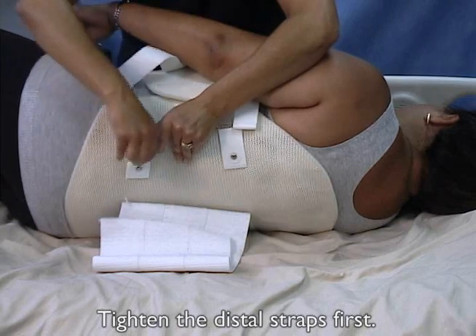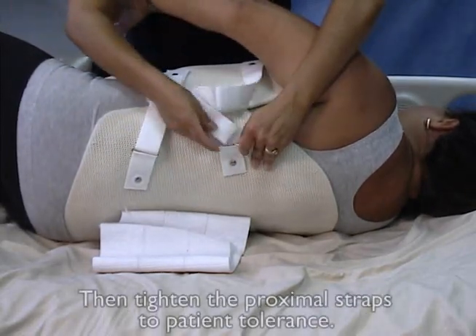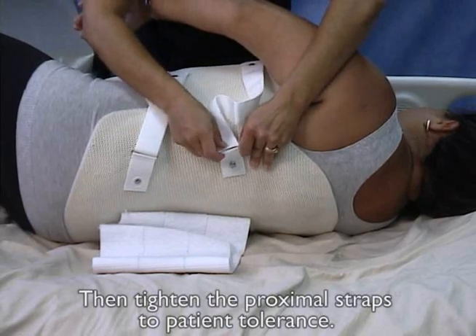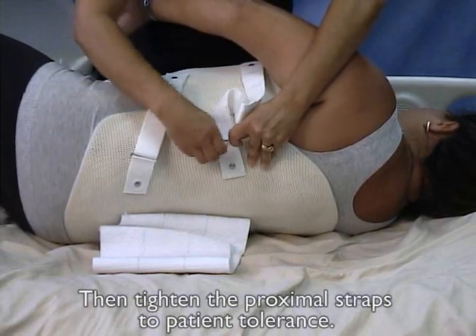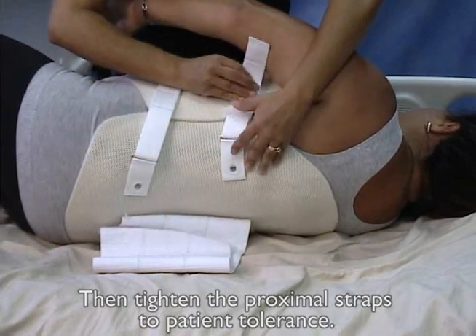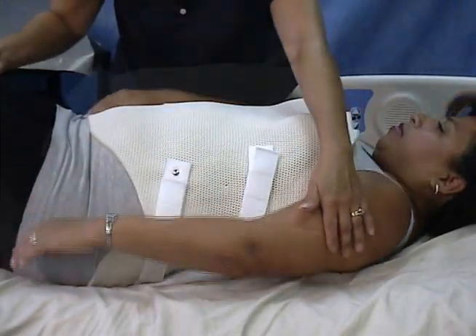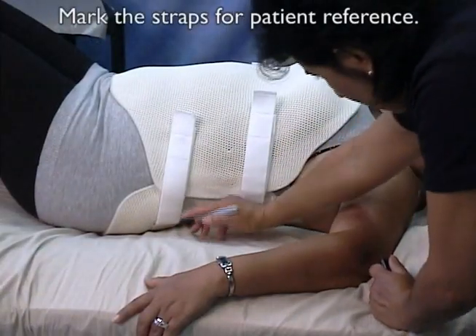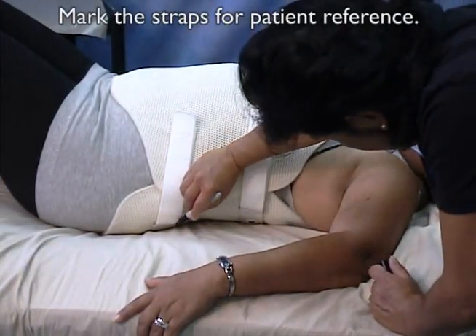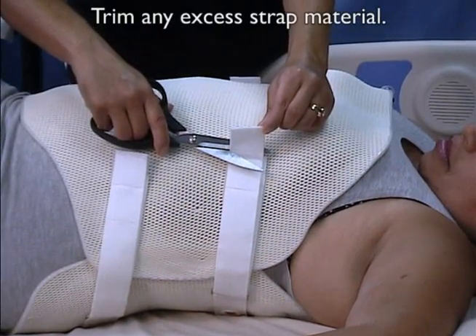Tighten the distal straps first, then tighten the proximal straps to patient tolerance. Mark the straps for patient reference to assure repeatable and consistent application. Trim any excess strap material.